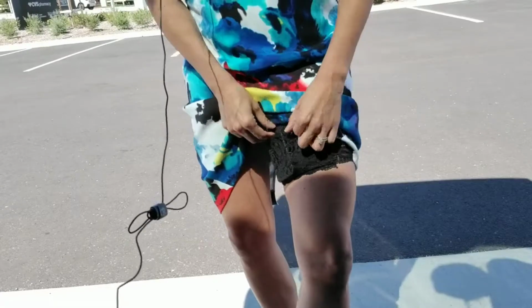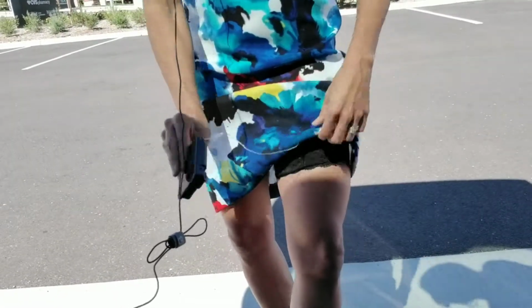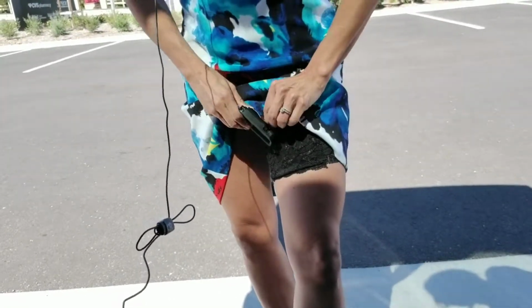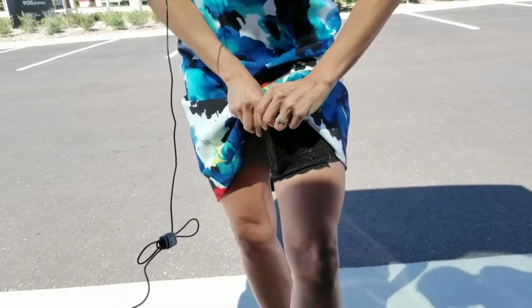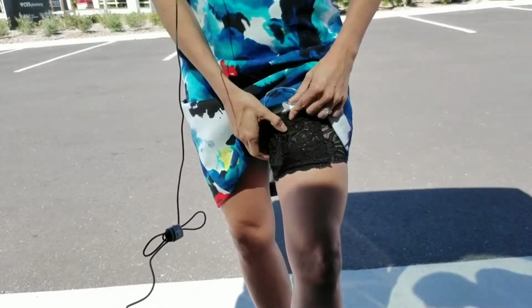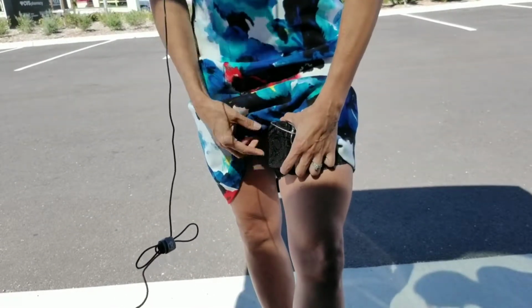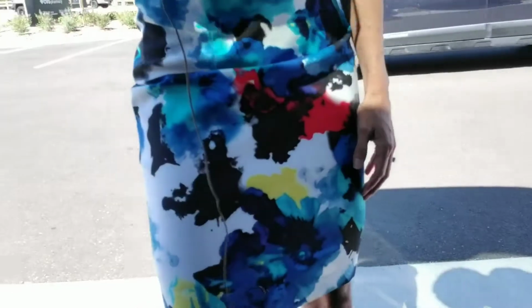There's a few ways that you can wear a pump with a dress. One of them is with the garter belt. You see, and now there's the pump. This is actually Christy's garter belt, and I'm going to tuck this back in. You just take it out to program your bolus or whatever you need to do, or, depending on the pump that you have, you can actually deliver a bolus straight through the garter.